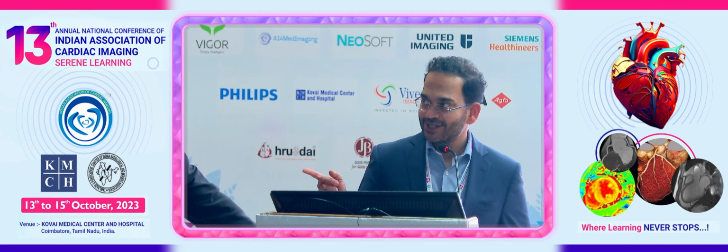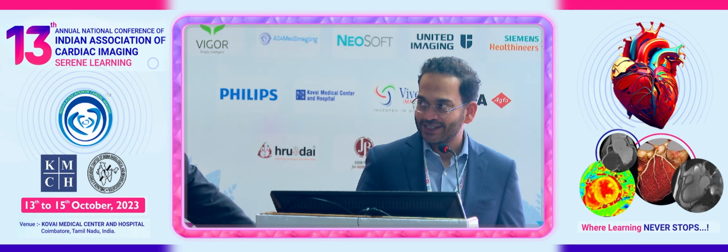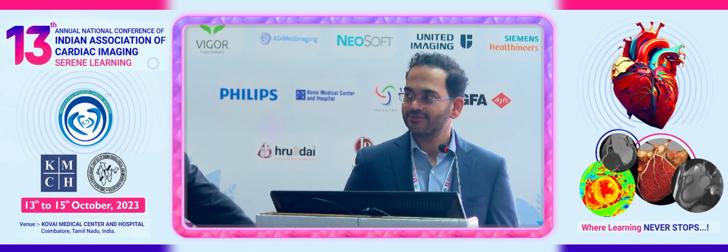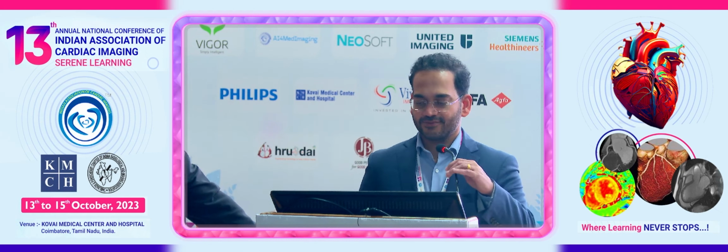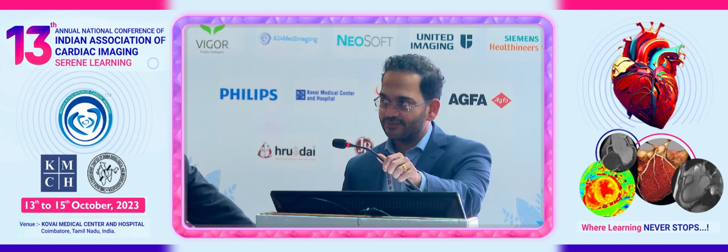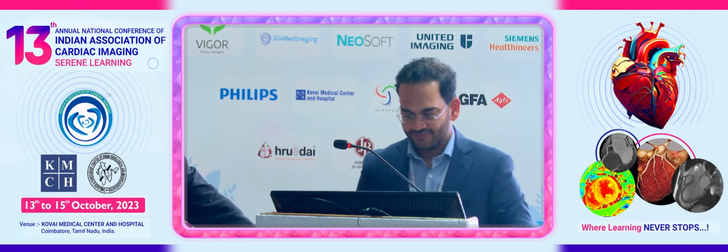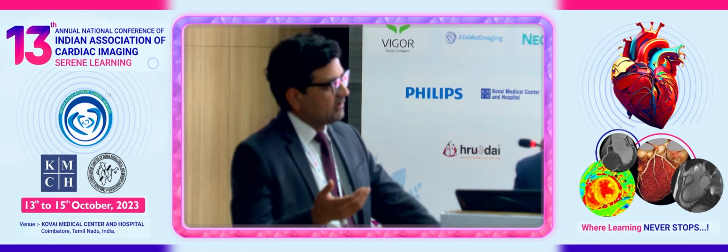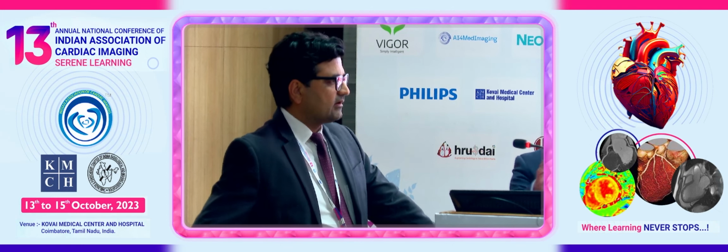So I will answer some, and it looks like Vineet also wants to say something about this question. I think there is a sub-study in PROMISE that showed it. And also there are more and more studies which don't look at the traditional 4 types of high-risk features. They look more at non-calcified plaque volume, and they have shown that those are associated.